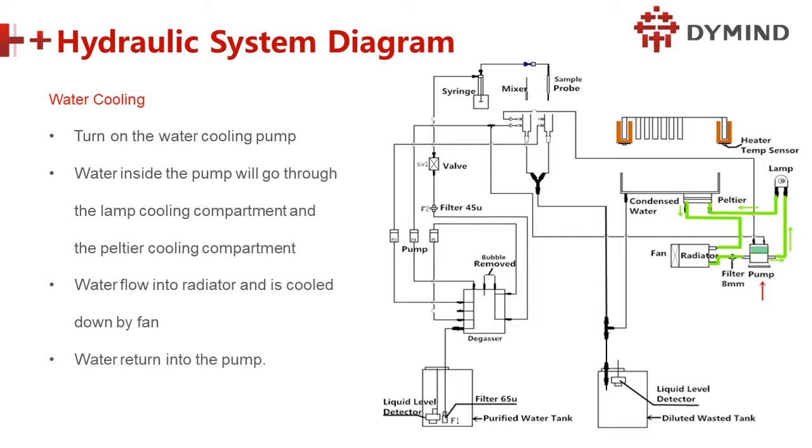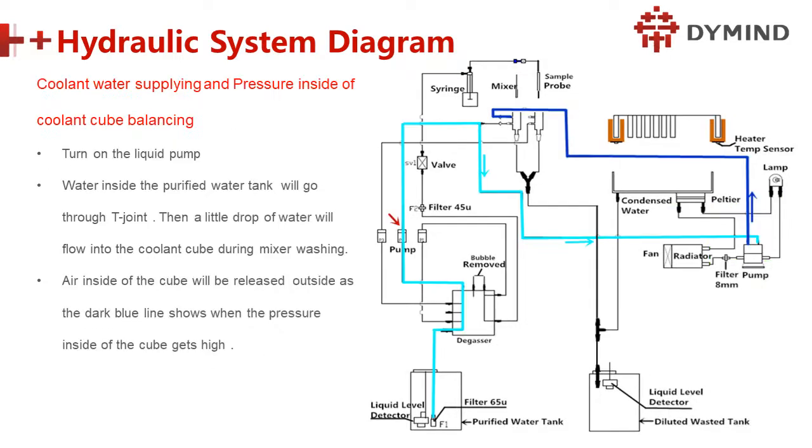Correct. Very correct. So you understand it very well. So the water here is doing the cycling, right? The direction is from left to right and up and to here. This is counterclockwise moving. Okay, remember, right?